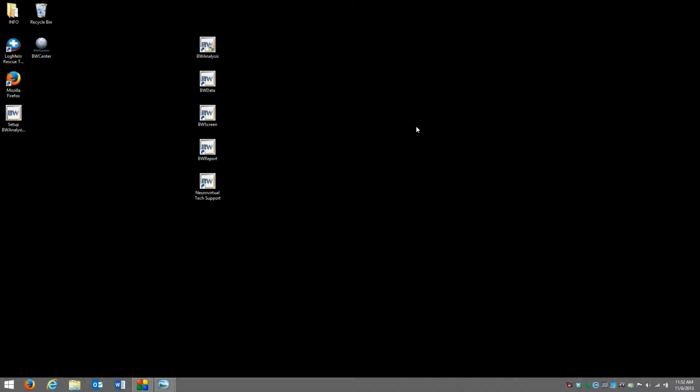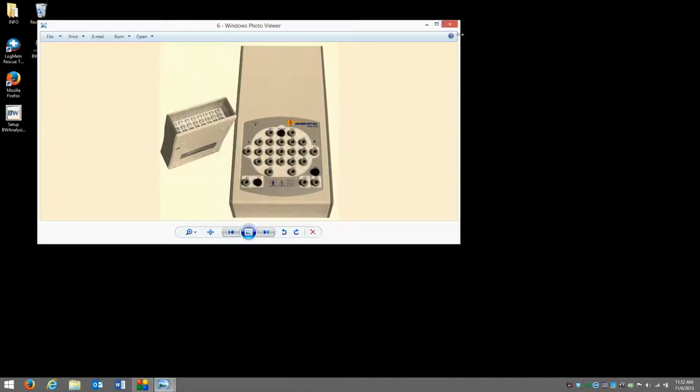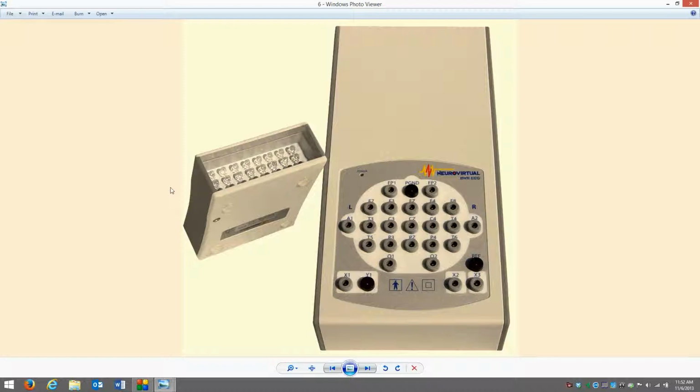Hello, this is Felipe Larita with Neuro Virtual, and today I will present how to operate the BW2 EEG and Bwanalysis EEG software. The BW2 EEG is a 25-channel EEG system.